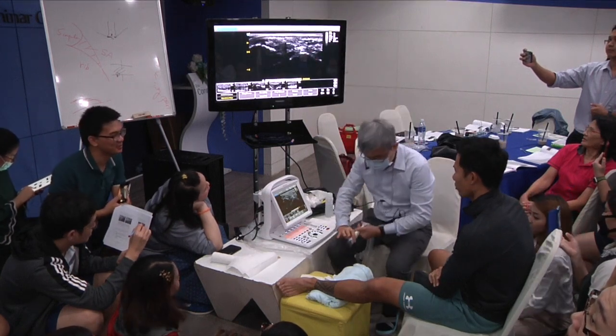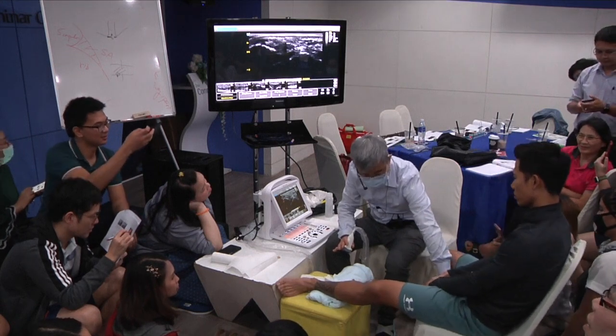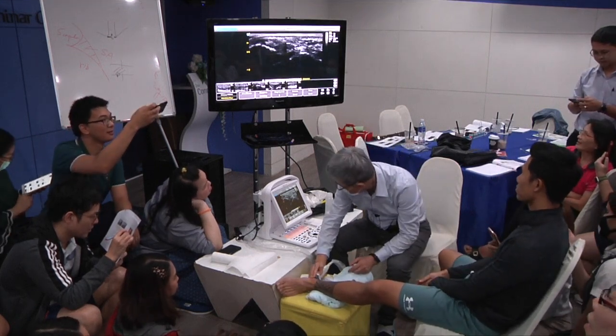Okay. Can you sit backwards a little bit? No, backwards. Yeah. Okay, thank you.